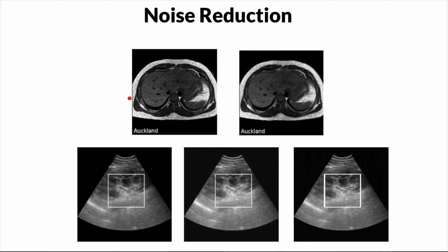So here you have two images. If you look here, you have noise here, but here it has been smoothed, right? Sometimes they use filtering. You have different types of filters to use. As I said, this one is not an image processing course where we will talk about some of these things and even write code for them. But what we do over here is related to AI. Then here also you see noise and that's also being filtered.